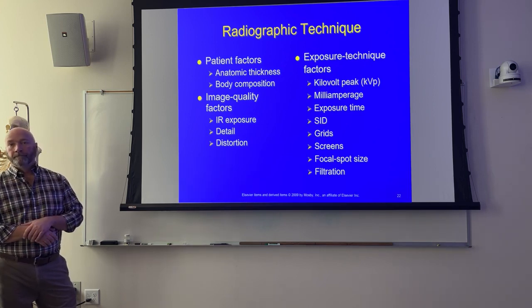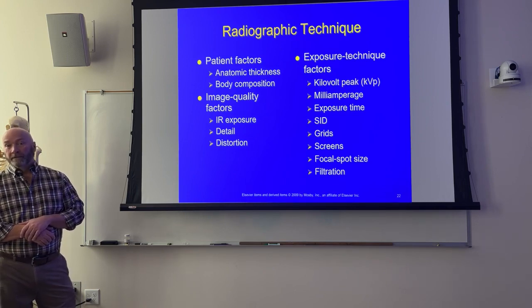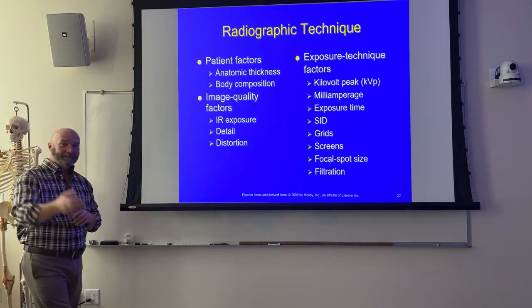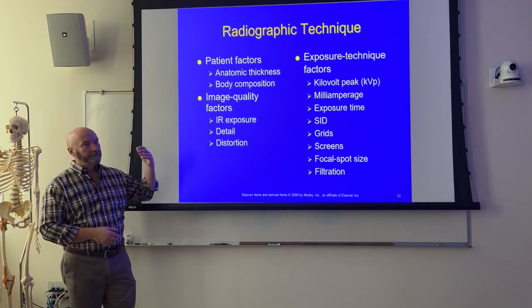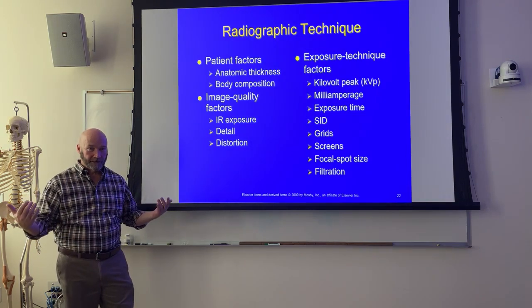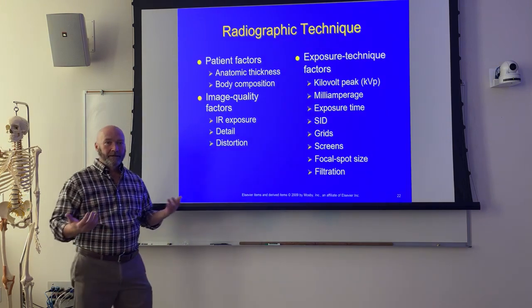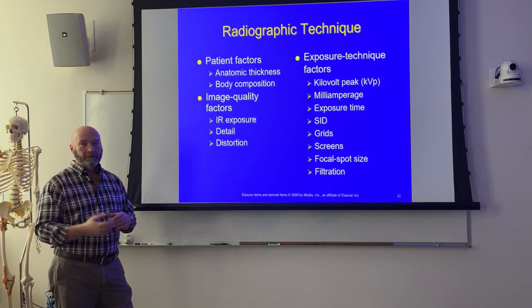So the takeaway from that is that the primary factors are only going to affect the output. I'm not going to expand on that and just confuse matters. Yes, the primary exposure factors are the things that affect output. Filtration and voltage waveform are secondary; they do affect output, but you don't change those, right? You don't change filtration. You don't have an option to select the other stuff. As a result, that's secondary. So I said I wasn't going to do that, and then I did it anyway.